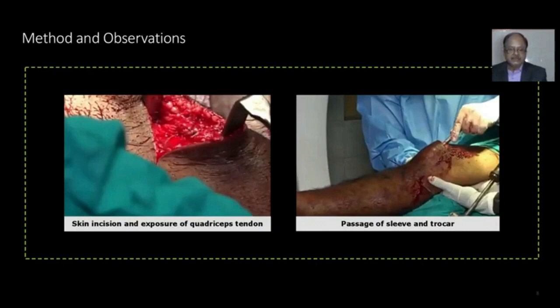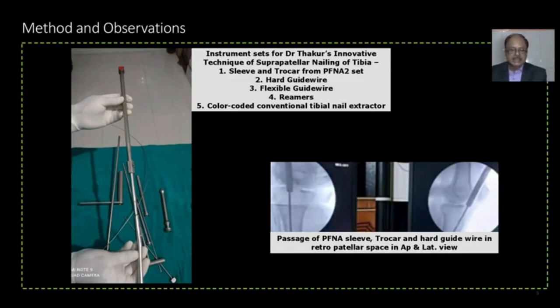These are pictures of how the cases were done using Dr. Thakur's innovative technique. The instruments include: the color-coded tibial nail extractor, protective sleeve from the PFN set, trocar and malleable guide wire, and stout hard guide wire. Images show the passage of the sleeve, trocar, and hard guide wire in the retropatellar space in both AP and lateral views.